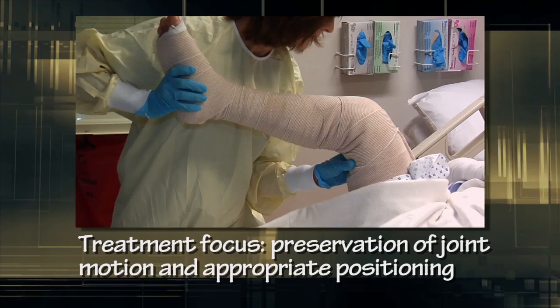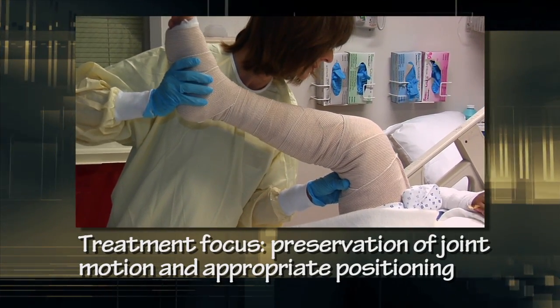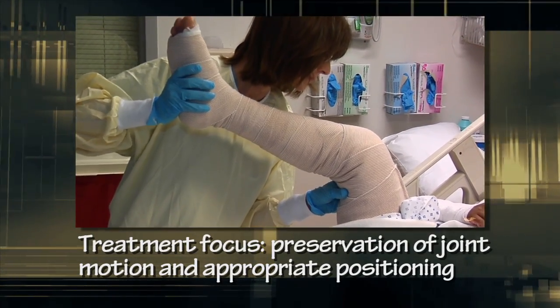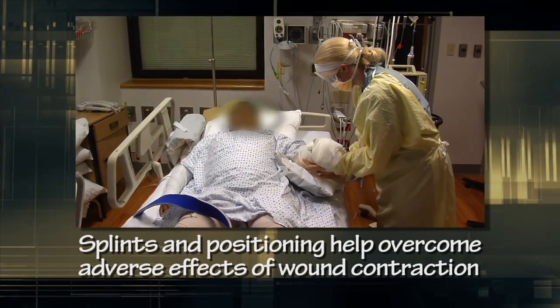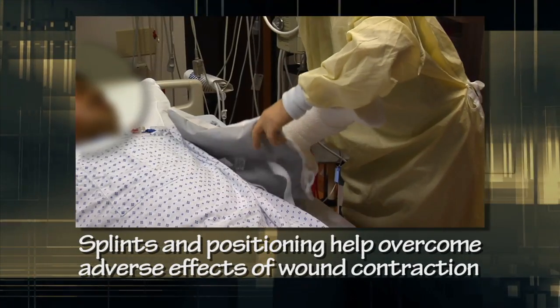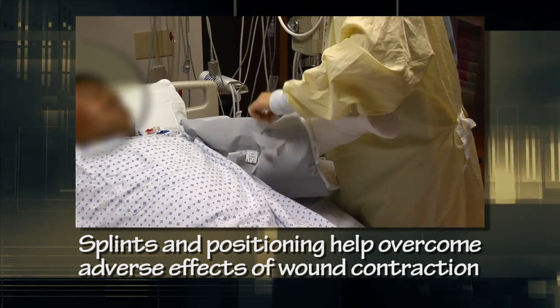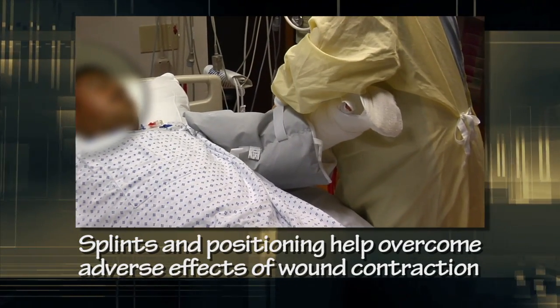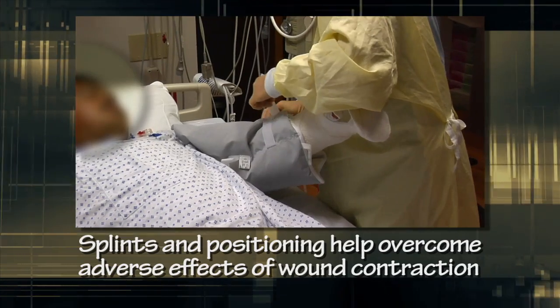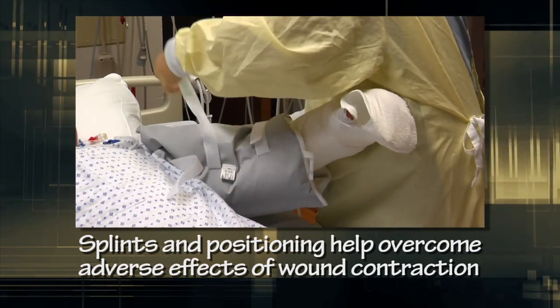Early treatment is focused on preservation of joint motion and appropriate positioning of the affected part during burn wound healing. In addition to range of motion therapies, splints and positioning often are required after wound closure to overcome the adverse effects of wound contraction. Careful patient monitoring and adjustment of the rehabilitation plan are necessary to optimize the functional result.